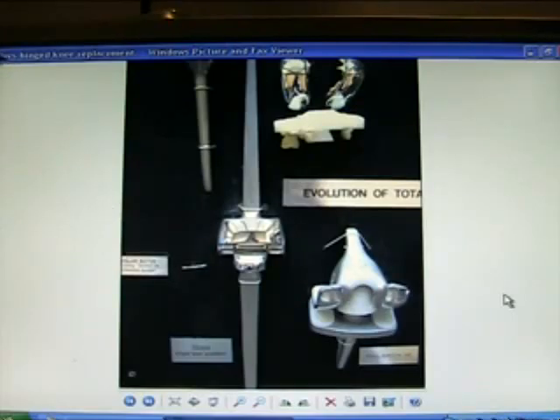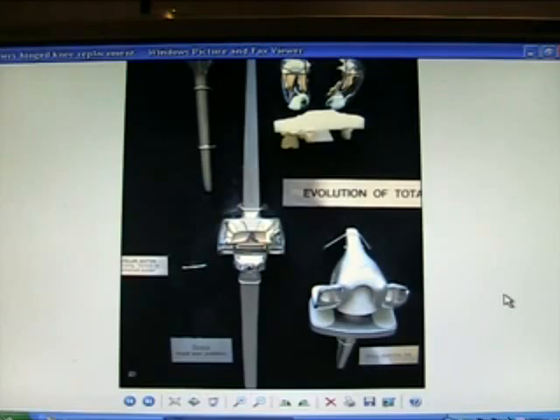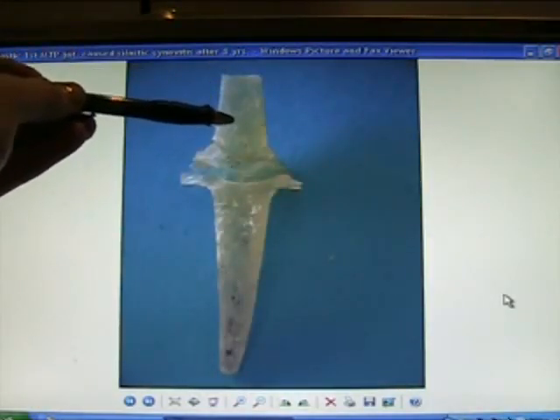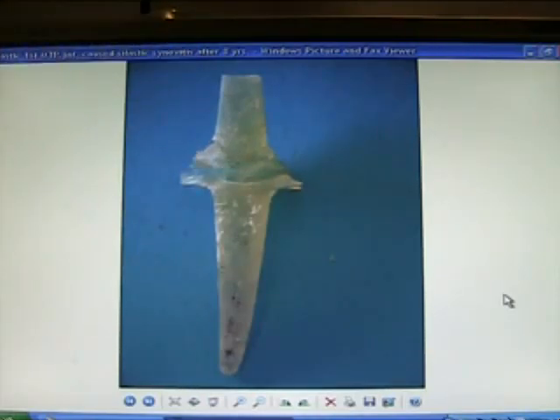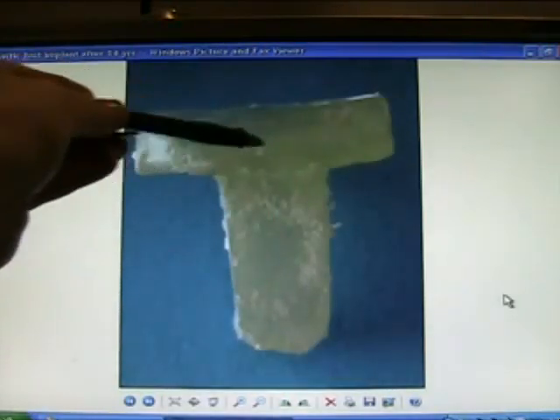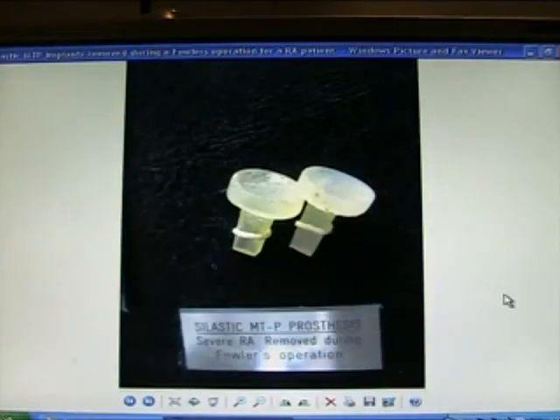The Shiers hinge knee replacement — S-H-I-E-R-S — was used in the 1960s and 70s. We don't use hinge knee replacements now. Here's a Silastic implant that was very popular in the 60s and 70s, but it causes Silastic synovitis after several years.